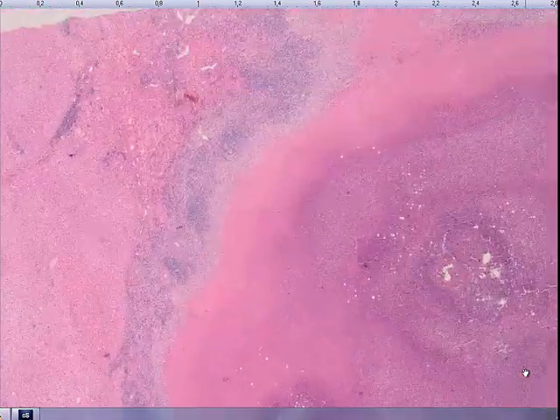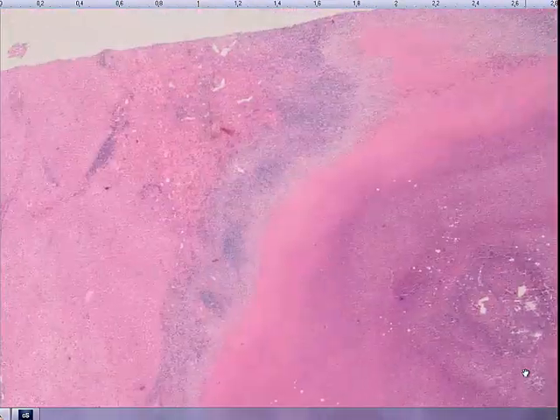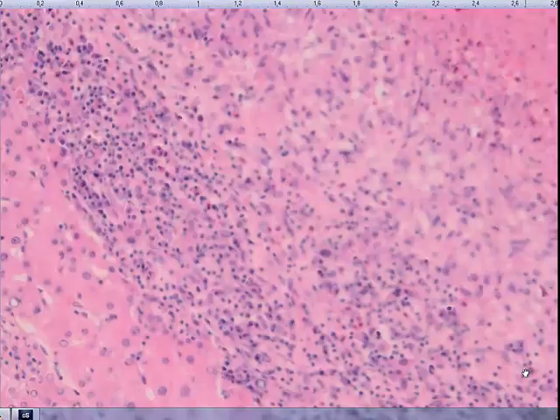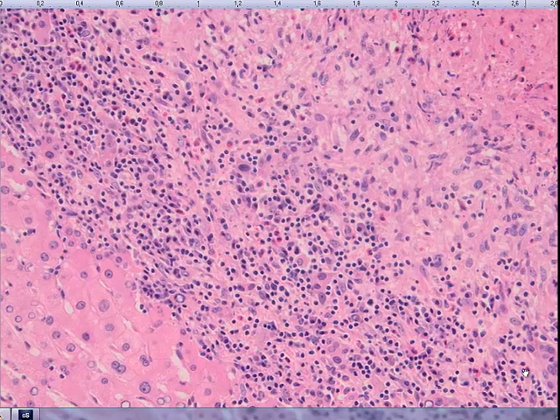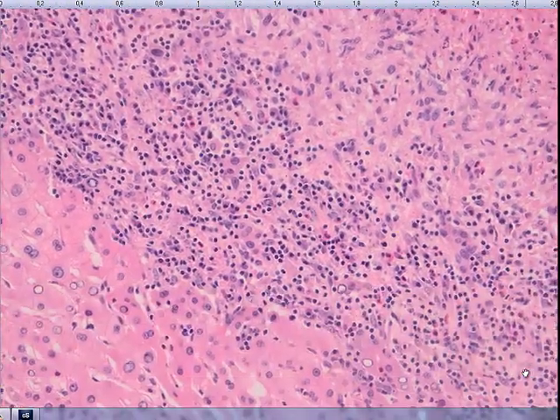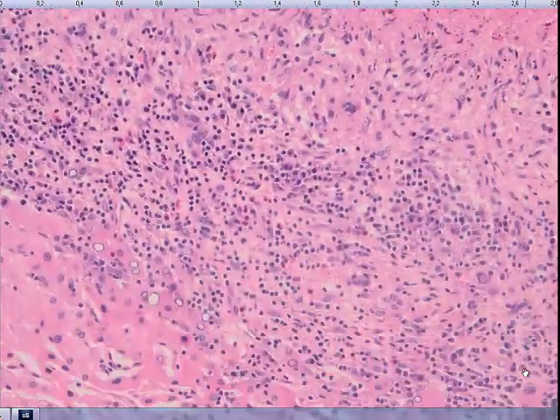When we look at the liver, as you can see, it is a fatty liver. There were several of these large necrotizing granulomas in the parenchyma, with the necrosis surrounded by these histiocytes. You can also see eos, a lot of eos actually, accompanying this granulomatous reaction.